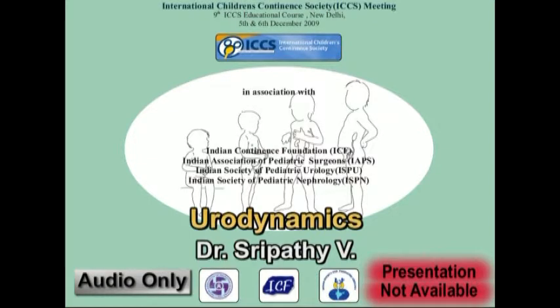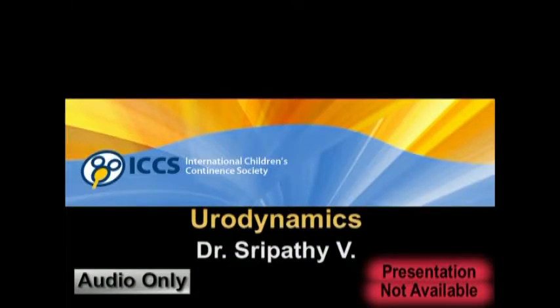At 8 years of age, the child was severely constipated, had a significant leak, was smelly with no friends and stood in a holding posture all the time. And that was the MCU and the DMSA at 2008, showing pronounced neurogenic changes in the bladder with left-sided reflux and a severely scarred kidney on the left side. And for us to explain to the parents what exactly was going on, and how to explain to the mother that it was her insistence that the child not pass urine in school that was the cause for this, Uroflow EMG was quite helpful.